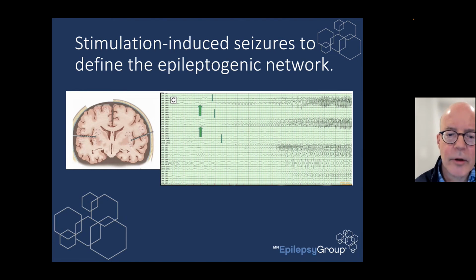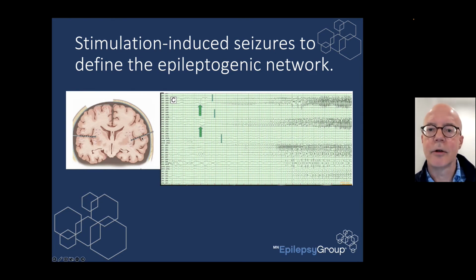So the stimulation procedure: one of the goals, as I say, is to actually stimulate the patient's typical seizure. So each of these electrodes, you're going to stimulate with electricity to try to get this. Let's say you're stimulating this electrode here, and suddenly you start seeing this seizure. You can see that rhythmic activity and see how it spreads. You would hope you would just produce the patient's usual seizure.